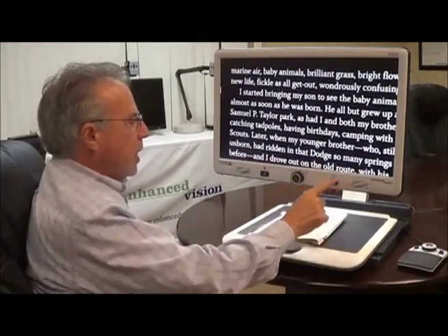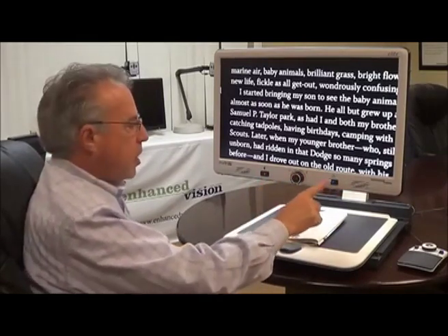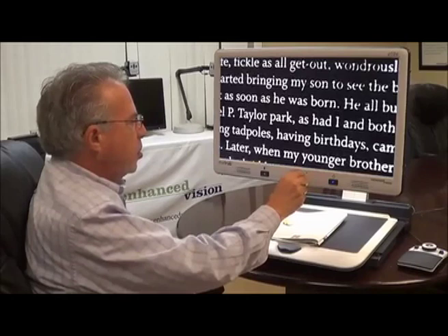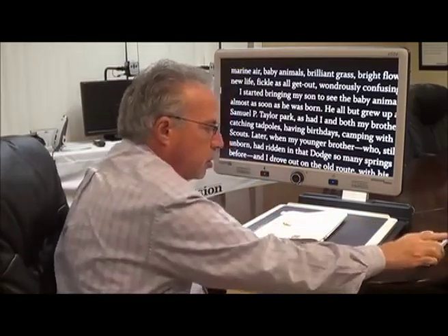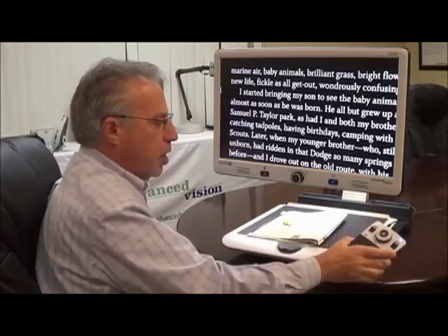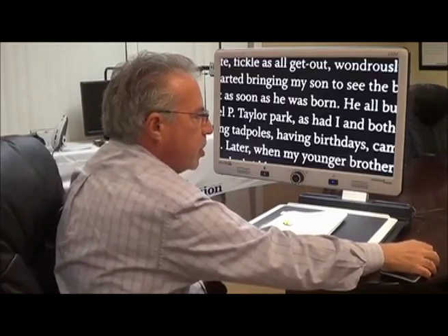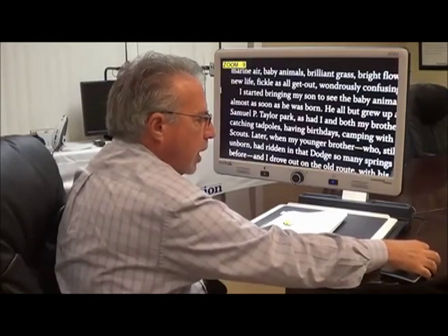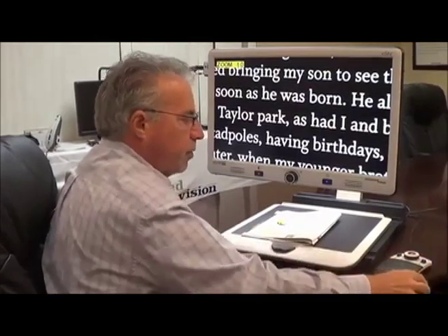As you notice, there's an easily accessible control panel that only has three controls: on-off, magnification, and mode. You can also duplicate those same adjustments with the controller, which is included. So, for example, if I wish to change the magnification, I can just rotate that wheel to whatever size magnification I require.